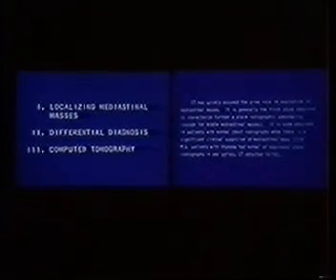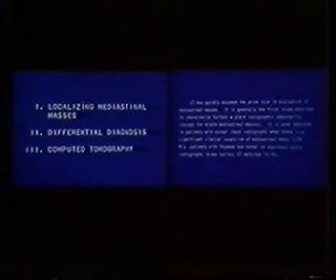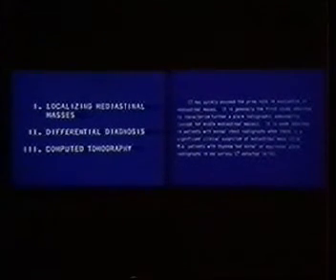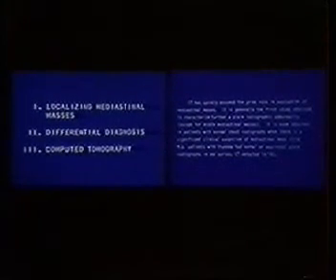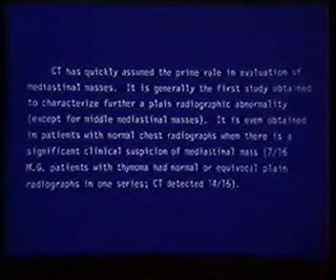Well, computed tomography is clearly something we're doing a lot of these days in patients with suspected mediastinal masses. I have no qualms about doing it in almost every case of a mediastinal mass, with the one exception that I mentioned before, that it might be worthwhile to start with a barium swallow when you've got a middle mediastinal mass. But CT is usually the first study you get after you've proven that somebody has some sort of plain radiographic abnormality that might be a mediastinal mass.